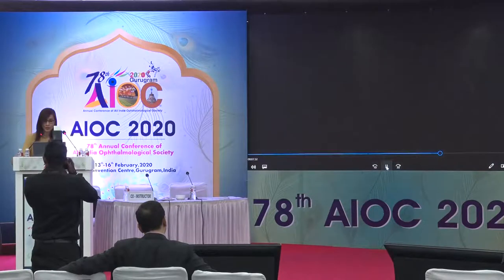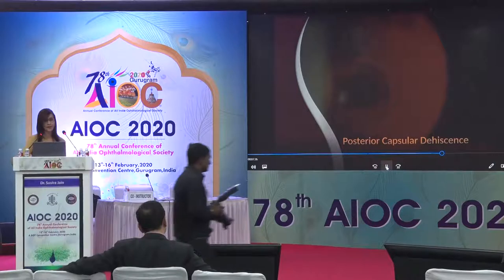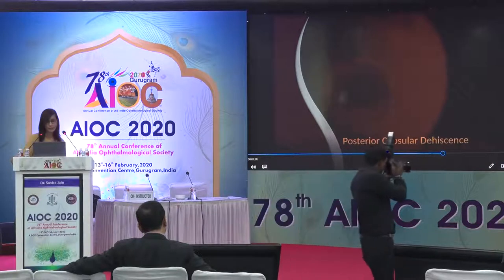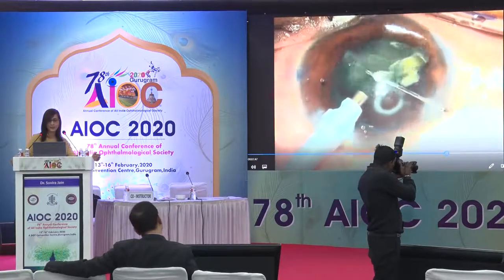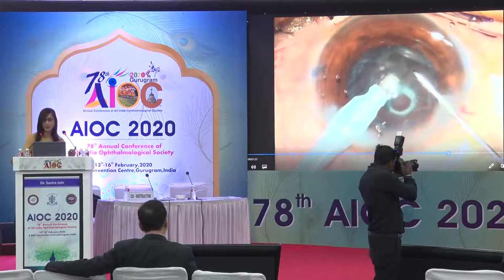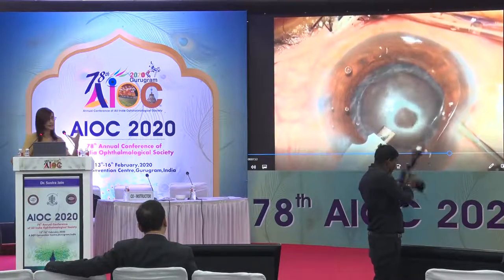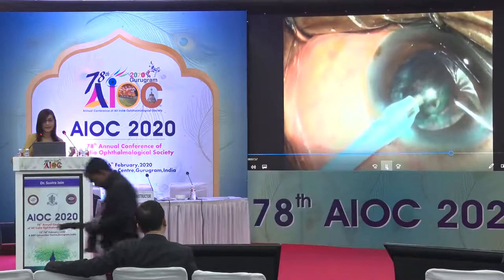I now come to the last part of my talk, addressing the open posterior capsule — different scenarios and the way they can be managed in a polar cataract. In case one, at the end of nuclear emulsification, you can see a little white ring underneath. That is not an opening in the posterior capsule — it is just a condensation of the posterior cortex, which is fairly typical.